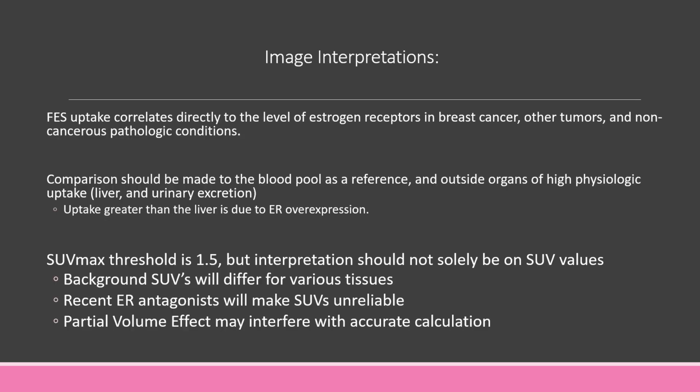FES uptake correlates directly to the level of estrogen receptors in breast cancer, other tumors, and non-cancerous pathologic conditions. Comparison should be made to the blood pool as a reference, and comparison should be made outside of organs of high physiologic uptake like the liver or urinary excretion. Uptake greater than the liver is due to estrogen receptor overexpression.